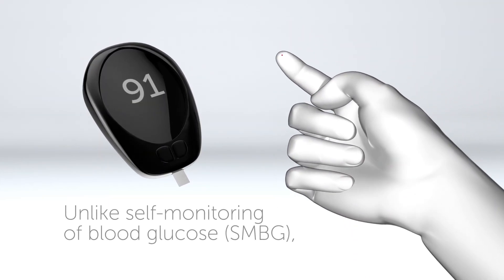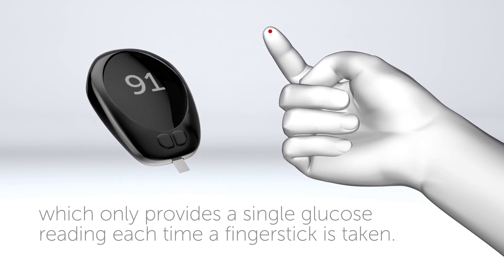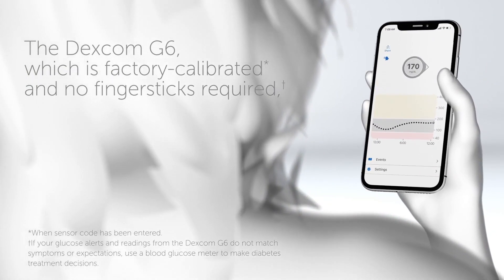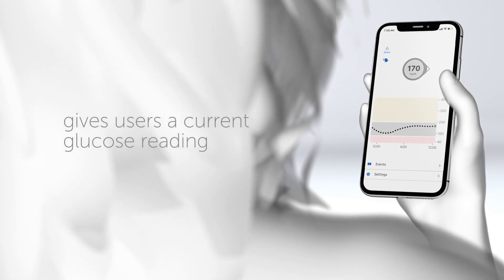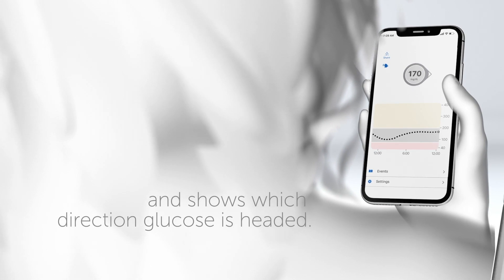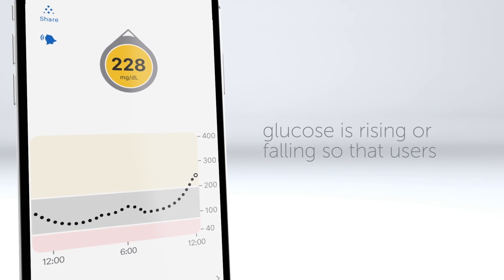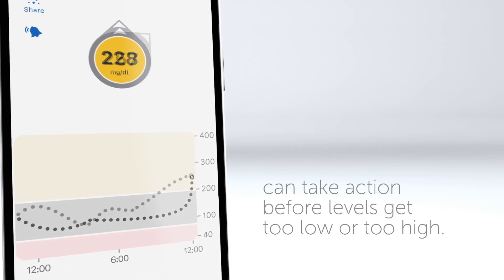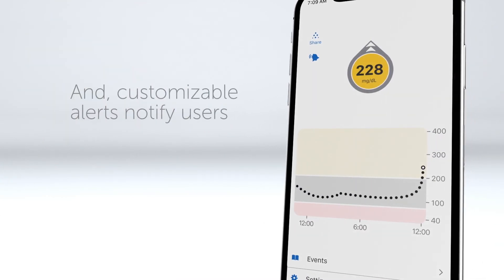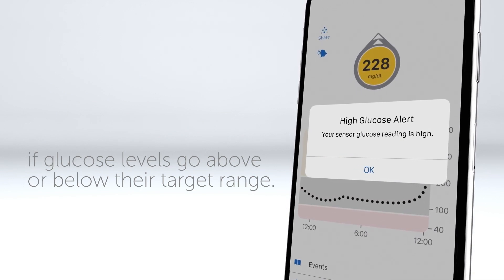Unlike self-monitoring of blood glucose, which only provides a single glucose reading each time a finger stick is taken, the Dexcom G6 is factory calibrated and requires no finger sticks. It gives users a current glucose reading and shows which direction glucose is headed. The trend arrow also shows how fast glucose is rising or falling so that users can take action before levels get too low or too high. Customizable alerts notify users if glucose levels go above or below their target range.